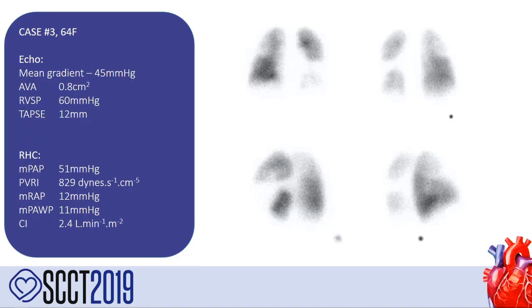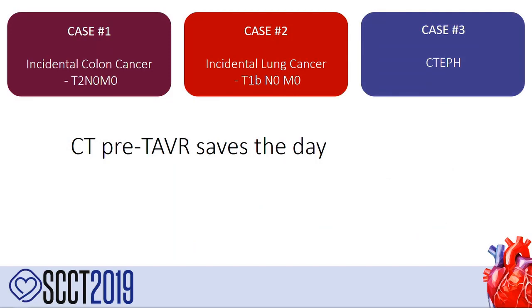And indeed, this patient was sent on to the cath lab and onto the SPECT VQ, which showed multiple perfusion defects with no matched ventilatory defect. So this is a case of chronic thromboembolic pulmonary hypertension, although with the normal CT before this, we know that there's no central operable disease. This is a peripheral variant of chronic thromboembolic pulmonary hypertension. So 3 cases, 3 incidental findings, 1 colon cancer, 1 lung cancer, and 1 chronic thromboembolic pulmonary hypertension.